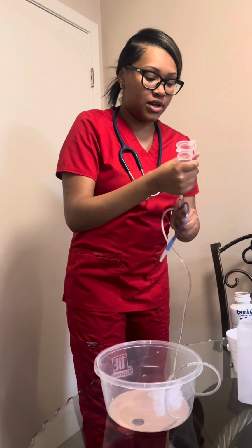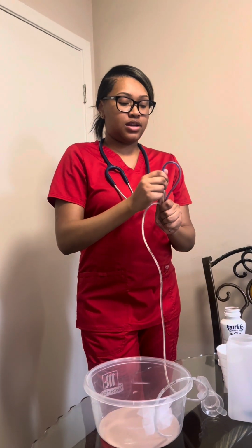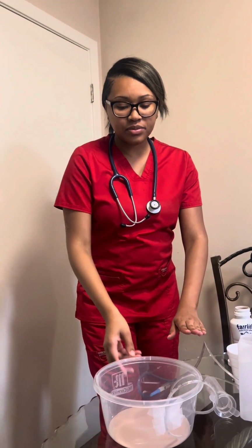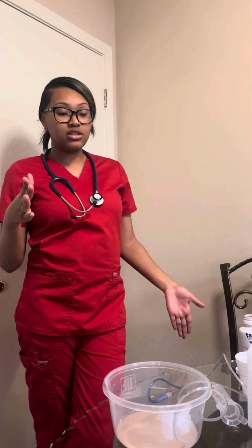And then I would pull this out, clamp it back, and I would administer water to the patient between feedings or as ordered. I would leave my patient in semi-Fowler's position to promote gastric emptying and to make sure that the patient doesn't experience any vomiting or aspiration.